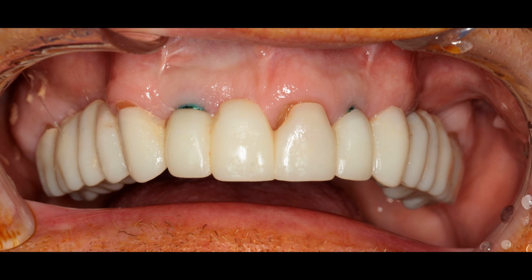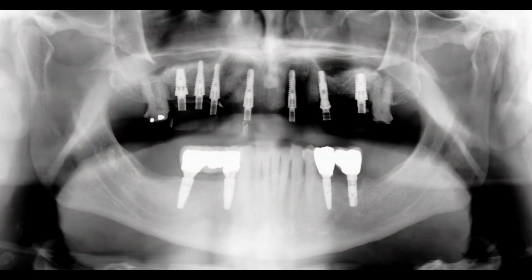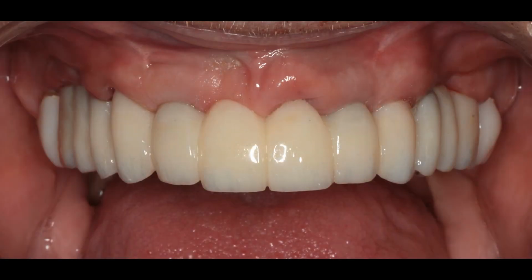Then we take out the remaining front teeth, place more implants, and leave the 2 molars, because if you notice, the back molars only barely touch the lower teeth as it is, but it's enough pressure that he can feel how hard he's biting. So that's his post-surgical radiograph, and that's the way his temporary looks on the implants in front and the 2 teeth in back.